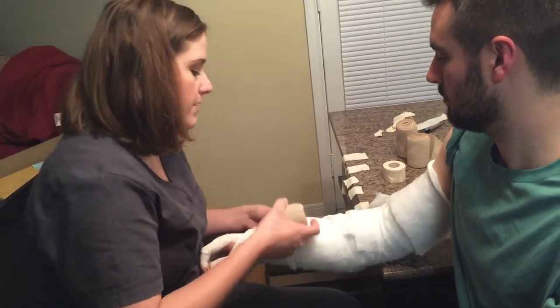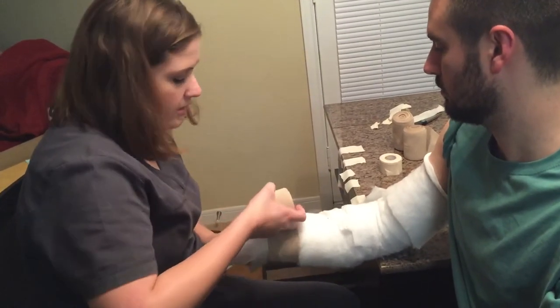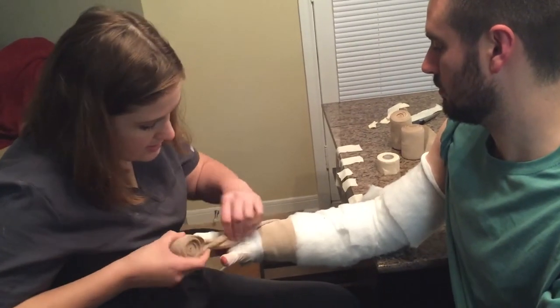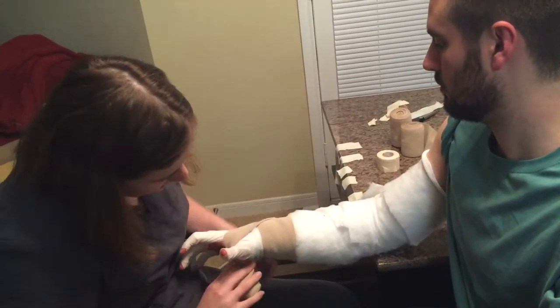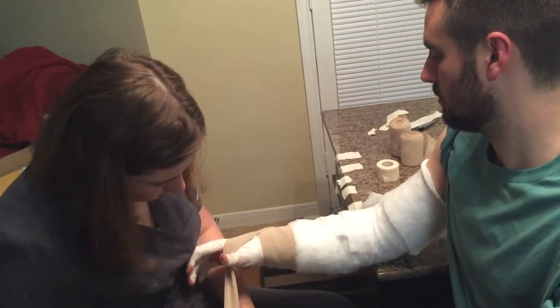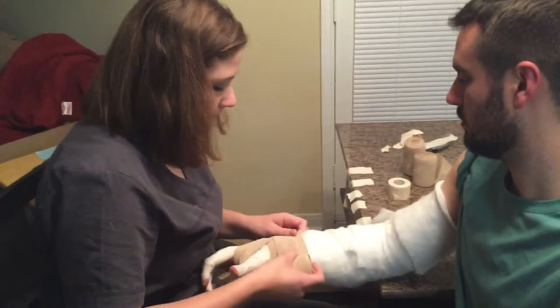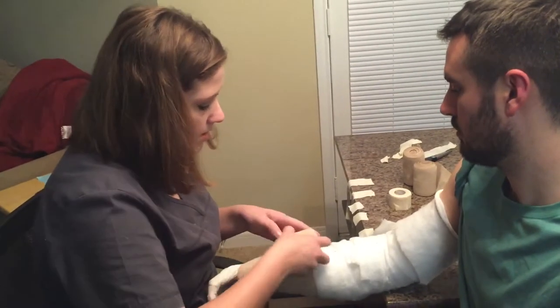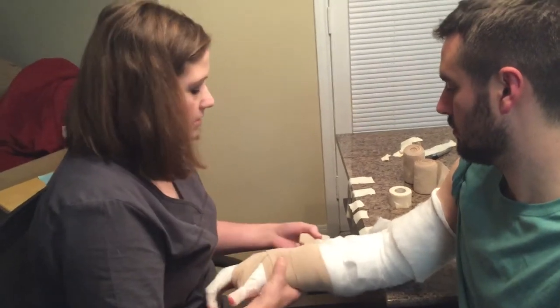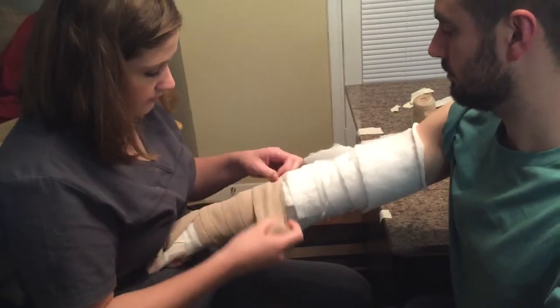Remember that bone right there — you still want to go above that bone. You're going to anchor it around a couple times, come down here, and when you get right here, just kind of bend it like that so that we don't get any material into your thumb that's going to be uncomfortable for you. Now that we have that done, we just want to make sure that you wrap 50% overlap across each time. Just keep getting up like this. Just keep wrapping.